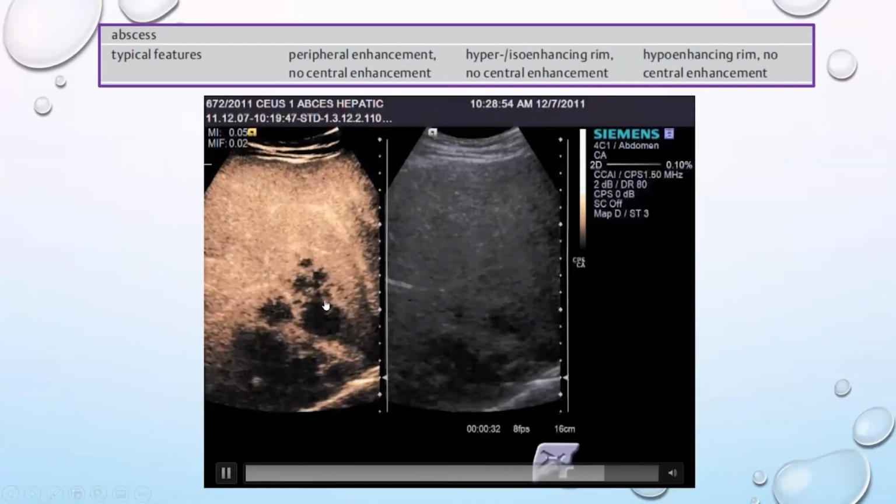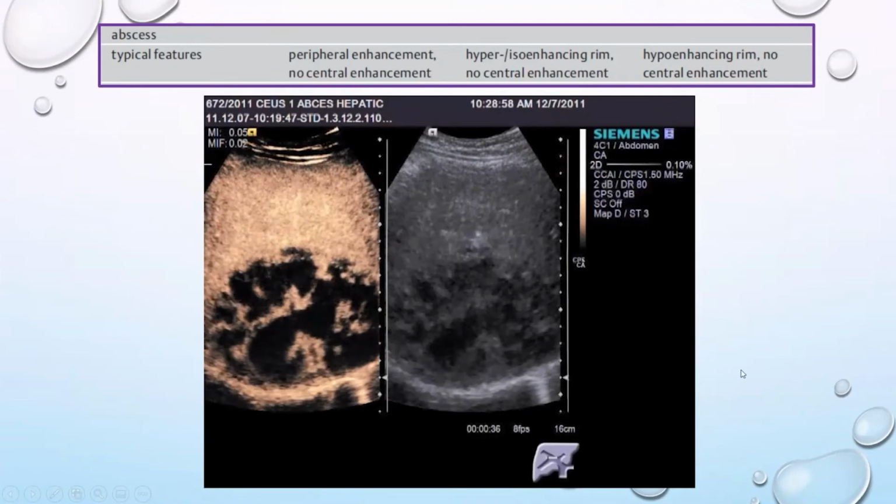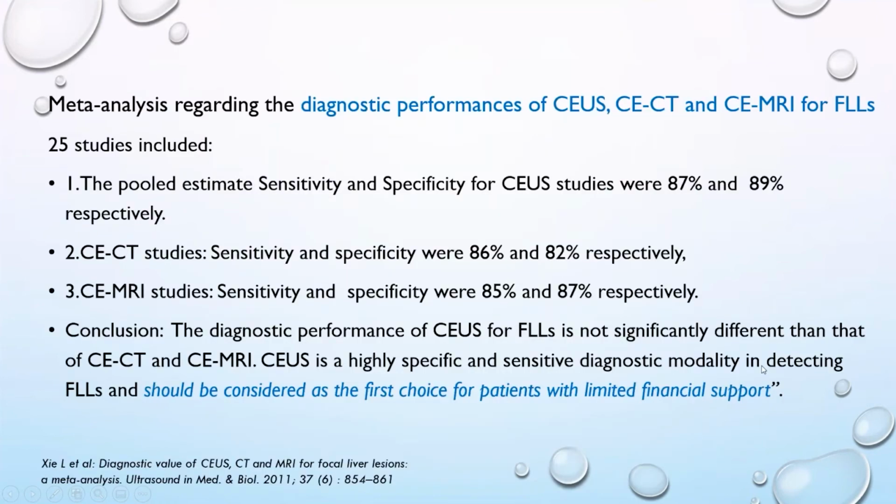And again, the clinical aspect is very, very important, because you are going to judge this patient knowing the clinical features that brought the patient to the doctor. You have already found some of the information that I'm going to tell you next. The technique has been on the market for a long time, and there are a lot of studies that showed that it has good performance regarding the characterization of focal liver lesions.